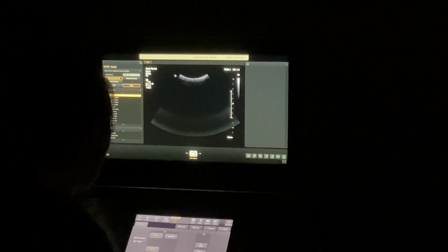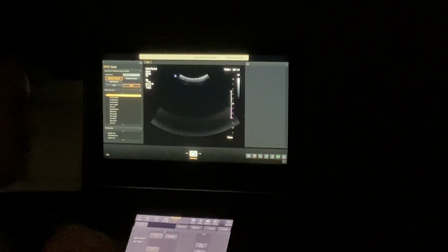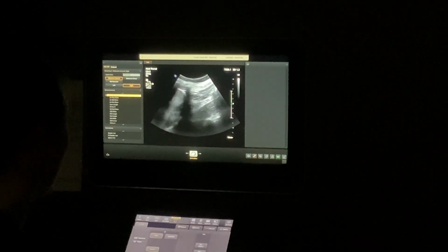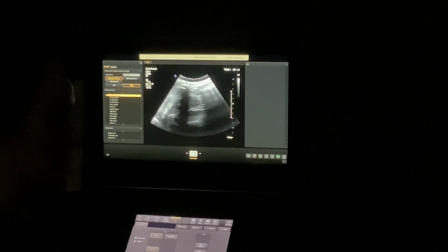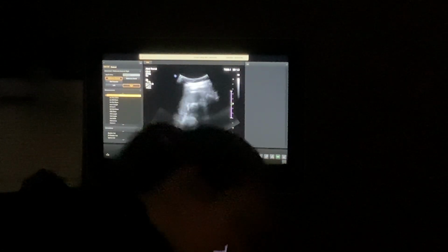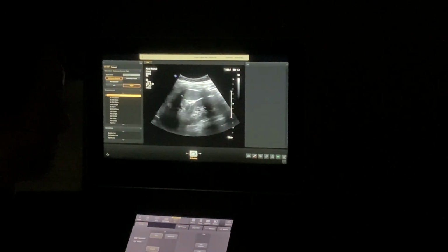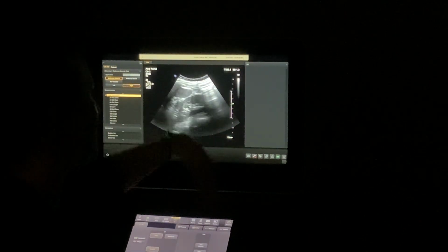When you roll things, just like the gallbladder, you guys got your first taste of that whenever you did gallbladder. When you rolled them, did it not completely change how that looked? Yeah. Okay. This is gonna create a different window because things are gonna lay a little bit different when she's on her side. Push your belly out. So pushing the belly out, if the organ sits further back, is only going to push it further back. If it sits deeper and you want to come closer to the surface, pushing the belly out really does help. With the pancreas, the deeper the pancreas sits, you pushed your belly out, you brought it closer to the surface. It made it easier, right? Same thing. Her pushing her belly out helped a little, but I have all this gas.